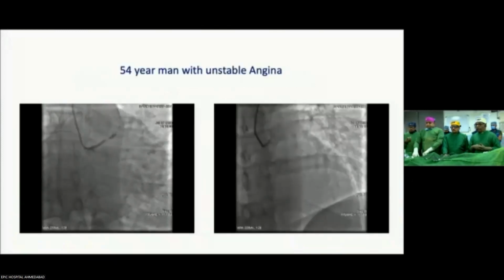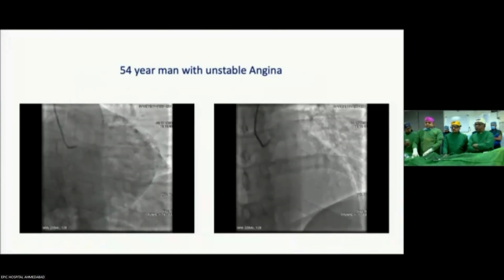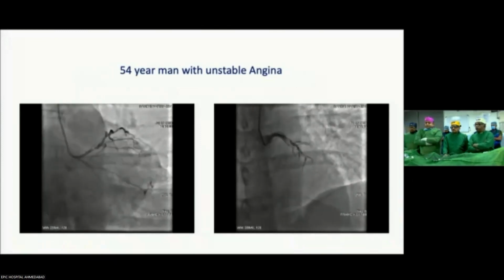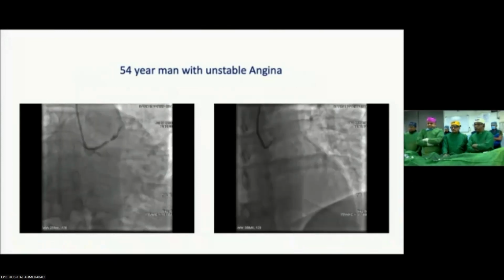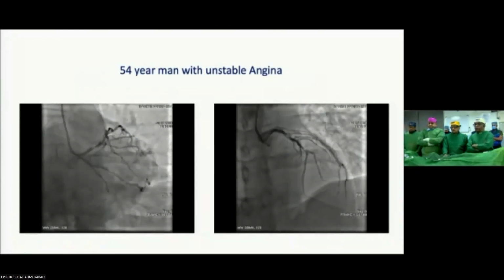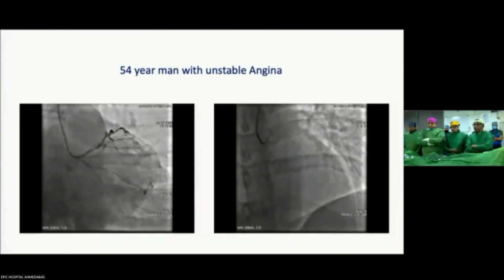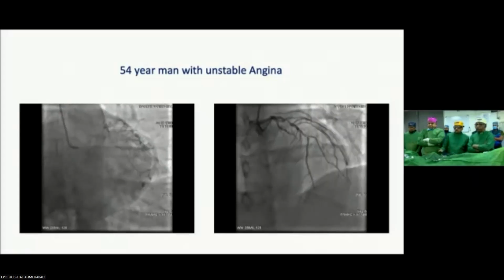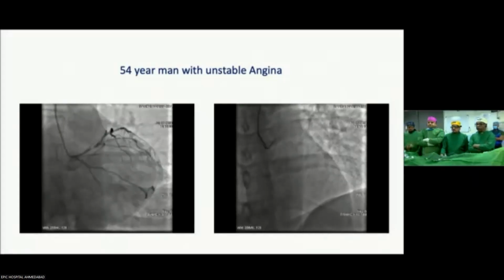So what we planned, this was the case. Proximal LAD, tight, fibrotic, 90% lesion. And if you see the cranial view, a large diagonal bifurcation, almost 90% lesion. The plan was probably rota or IVL with OCT guidance. Unfortunately, this gentleman developed a severe urinary tract infection, counts more than 20,000. Obviously, we cannot do the case today, so what we are doing is a backup case.